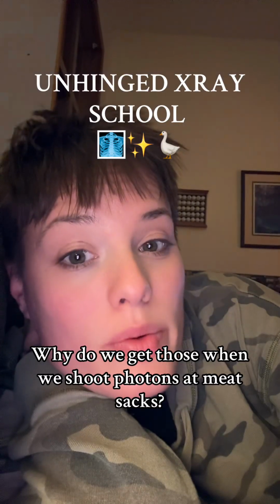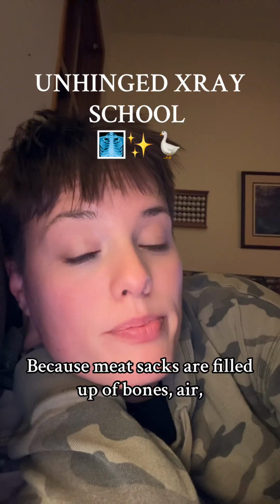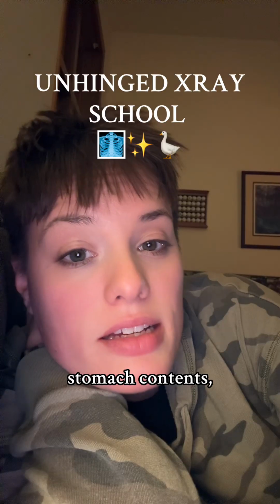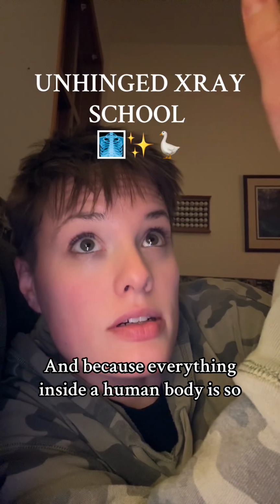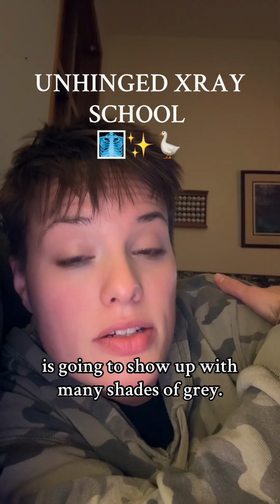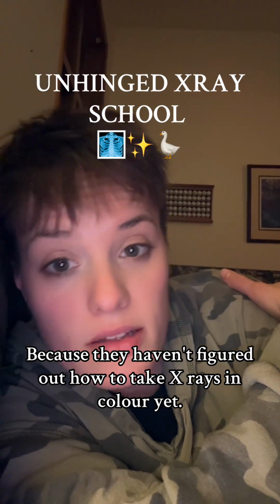Why do we get those when we shoot photons at meat sacks? Because meat sacks are filled up of bones, air, stomach contents, aka internal organs. And because everything inside a human body is so densely different, the image is going to show up with many shades of gray because they haven't figured out how to take x-rays in color yet.